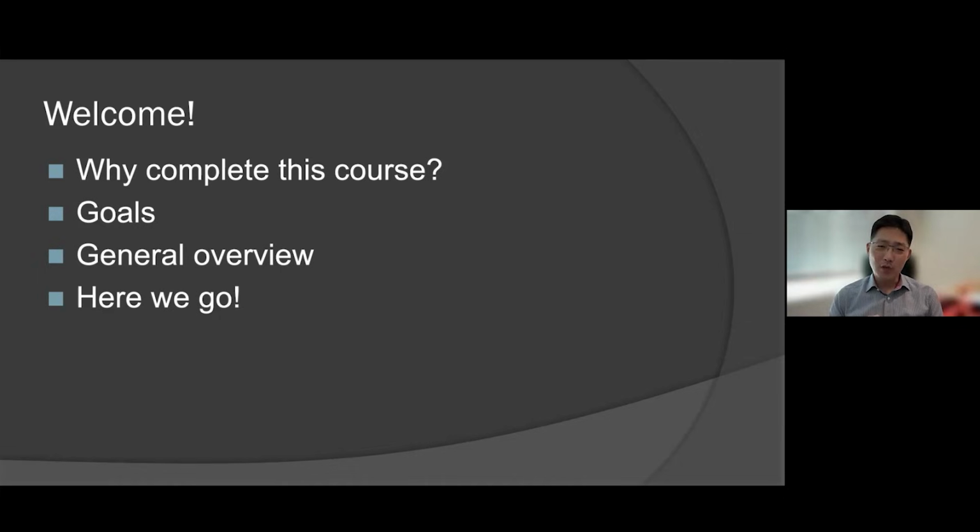So you have to read them, but your mastery, or at least your confidence, maybe you're actually pretty good at it, but your confidence in reading them is fairly low. So we want to get rid of that. We want to increase the confidence. We want to make sure the mastery is there in terms of ILD assessment.